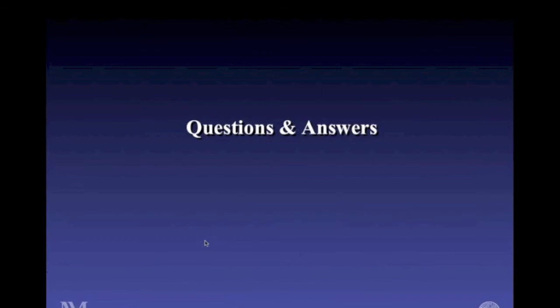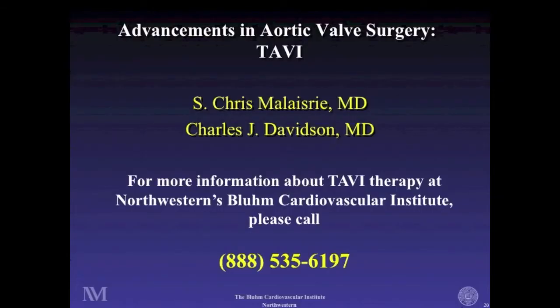I can pick up the first. Maybe we'll just alternate questions here, to make it easier. So the stroke risk for TAVR is currently running around 2 to 5% for the acute episode, and there is an accumulation of strokes that occur out to 1 and 2 years. When you compare it to surgical aortic valve replacement in high-risk patients, there is a slightly higher risk of stroke if somebody could qualify for both, although the recovery time seems to be the same and the death and outcome is about the same.